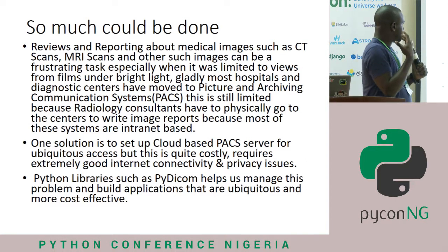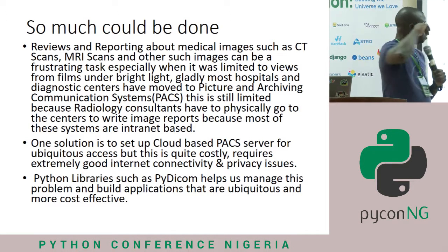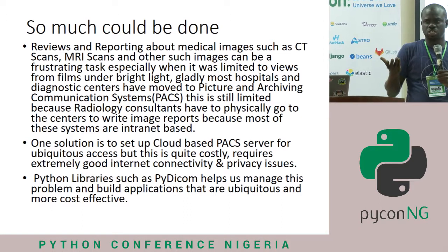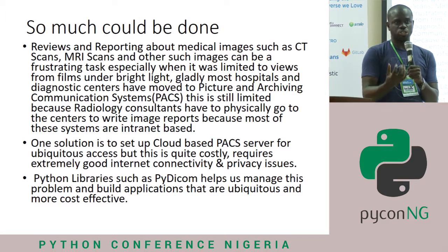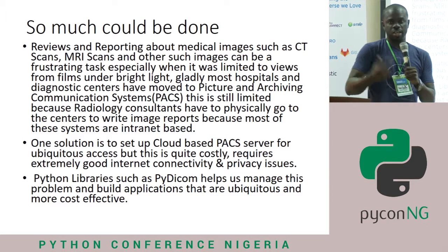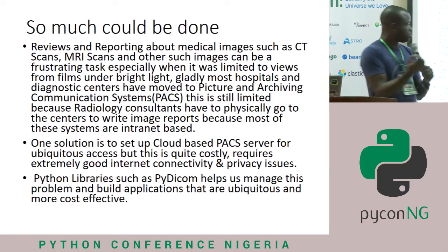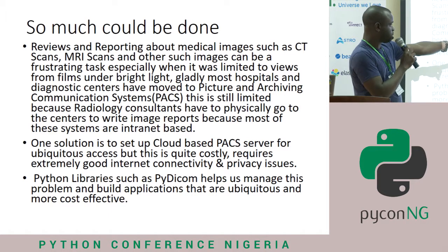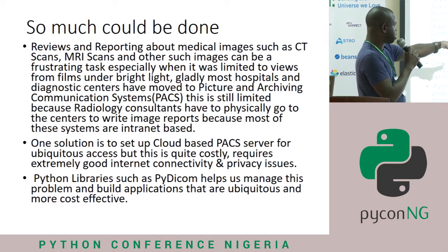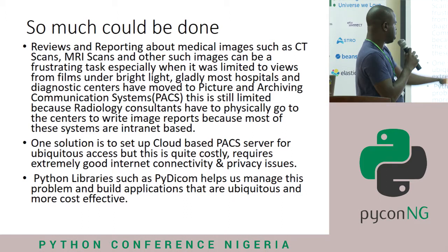This is still a bit limited because radiology consultants have to physically go to those centers to write reports. Really, when you're looking at that image, how much sense can you make of it? It's only those trained to look at those images who do what they call reporting, which can then be taken to another doctor in another discipline to give you care. So those radiology consultants have to go to several diagnostic centers to write image reports, because those systems are often intranet-based.